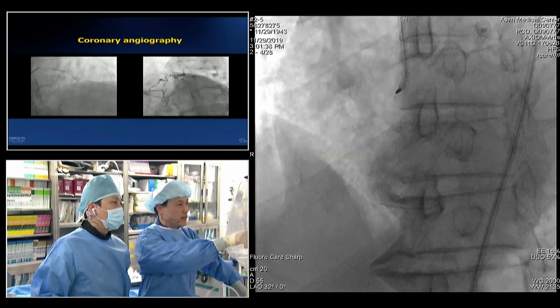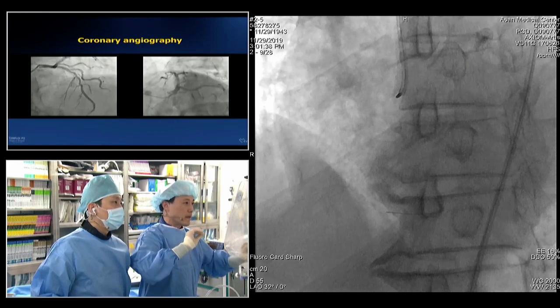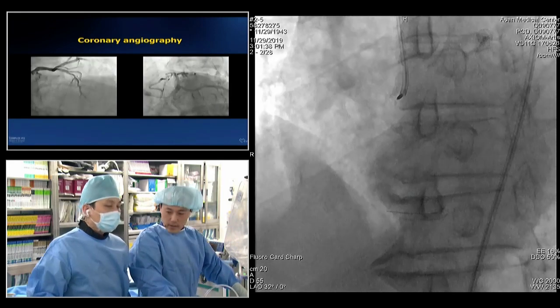Now, what I did right here was a little Dynaglide just to get the burr a little bit forward and clock the catheter, Dynaglide again. Eventually, we were able to get the 1.5 burr down.